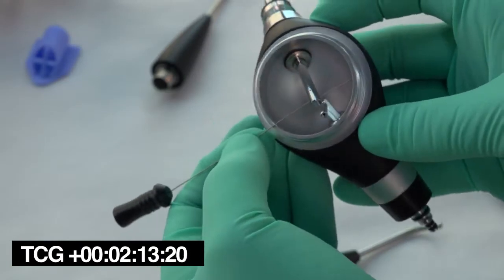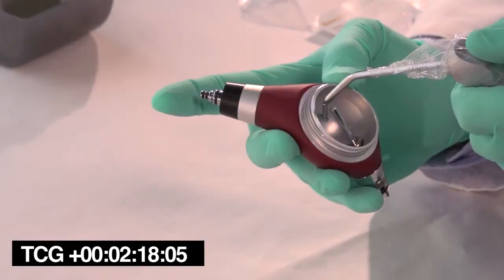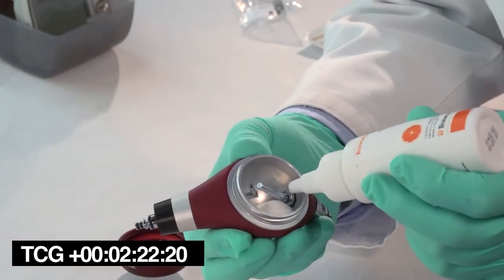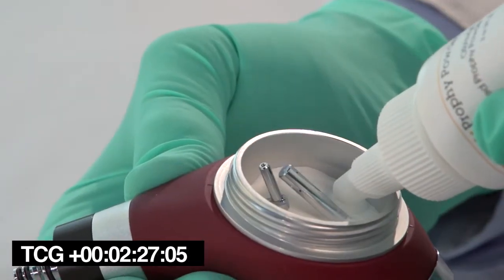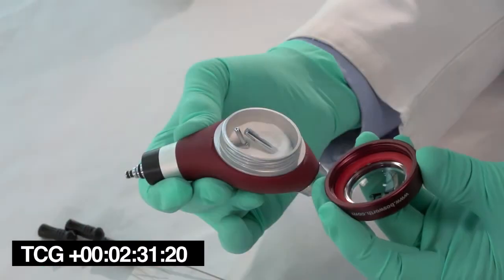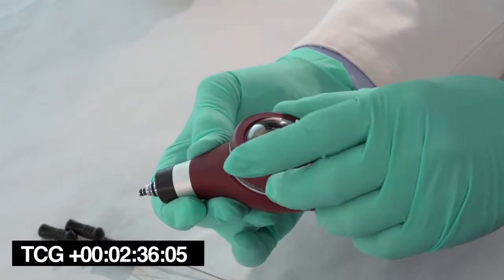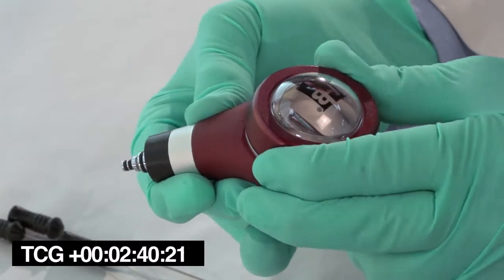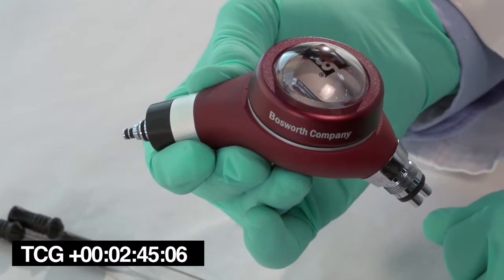Clean the ports of the powder chamber before filling using the cleaning wires and blowing them out with air. Wipe and clean the chamber out, after which fill the chamber with prophy powder. Do not fill past the fill line. Use only sodium bicarbonate. Place your cap back on the reservoir, being careful not to cross-thread or to turn the unit upside down. Lastly, tighten the cap, but do not over-tighten. Make sure no air escapes around the seal.